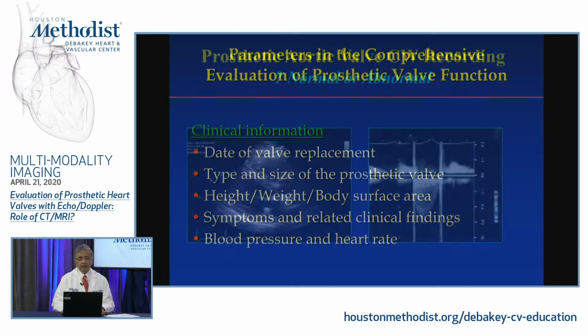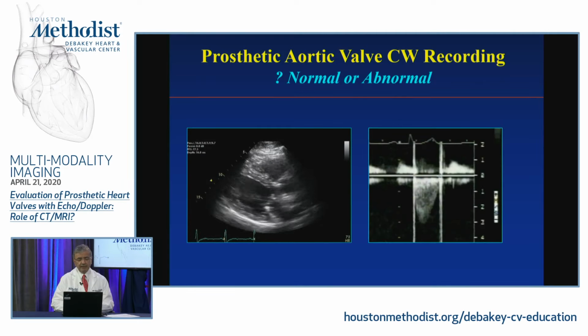Symptoms, blood pressure and heart rate are important. And let's take an example here. This is a prosthetic valve, mechanical in the aortic position.